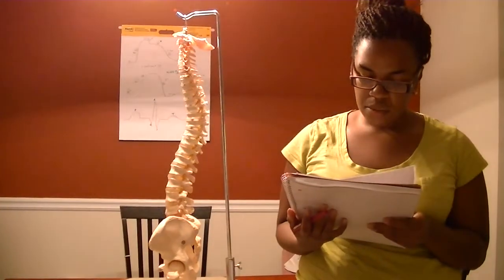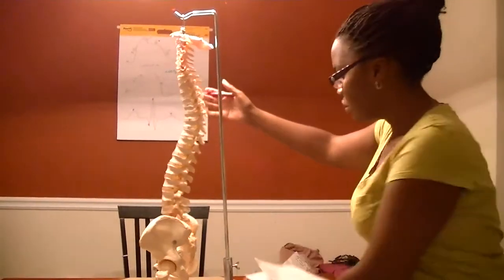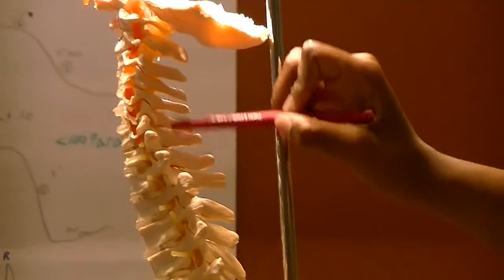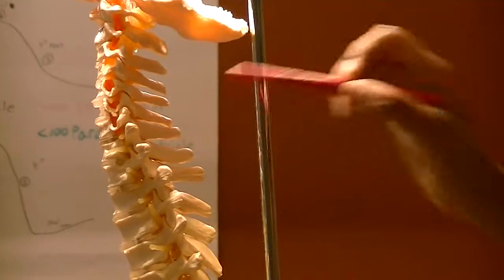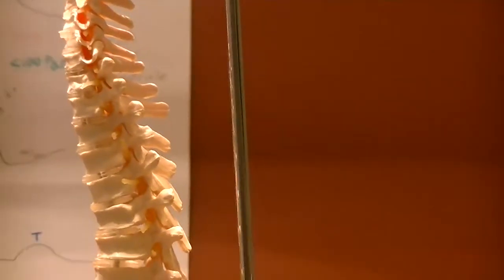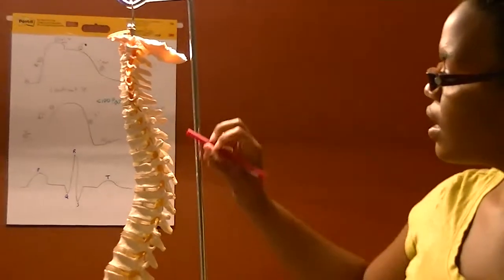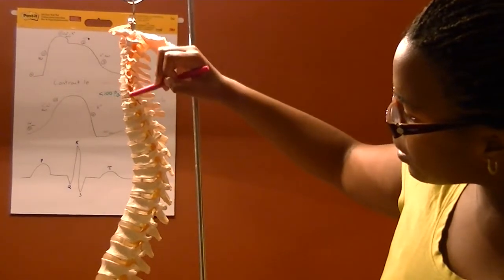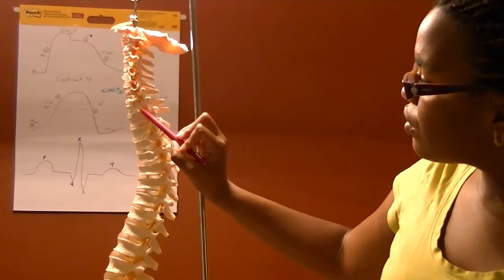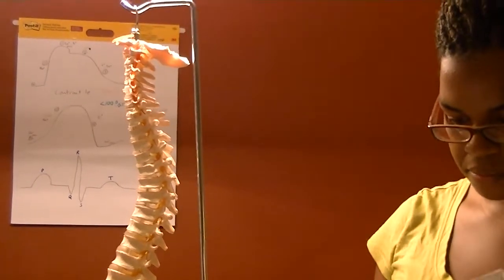The next line is going to be the posterior cervical line, and that's going to be shown, somewhat hard to see, but it's going to be shown right here along the spinolaminar junctions. The next one that we discussed was the A to P sagittal dimensions, and this is going to be shown from the George's line along the posterior aspect of the vertebral bodies and the posterior cervical line. So we're going to be measuring from here to here on an x-ray.